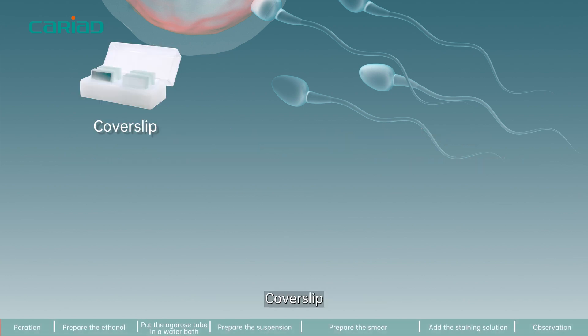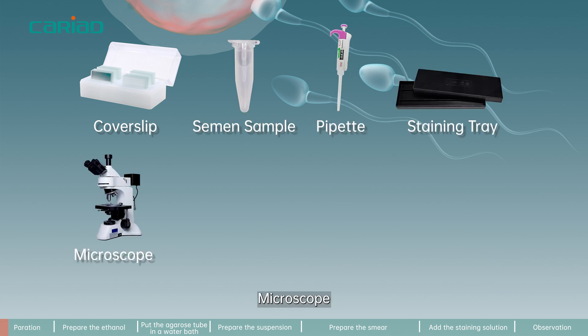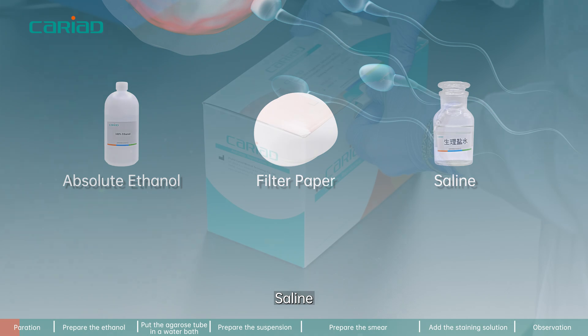Preparation before operation. Required materials include: coverslip, semen sample, pipette, staining tray, microscope, purified water, timer, water bath, absolute ethanol, filter paper, and saline.